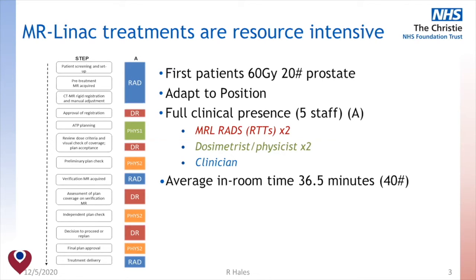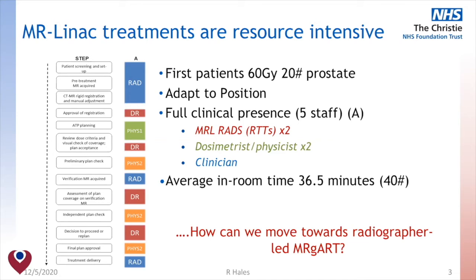So this led us to believe that with the acquisition of some extra skills, these adaptive radiotherapy fractions lend themselves to being radiographer-led, and this would offer a more sustainable solution for integration into a radiotherapy department.